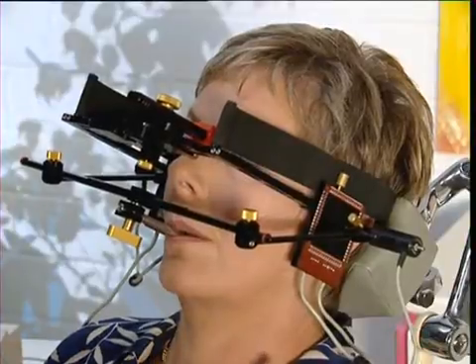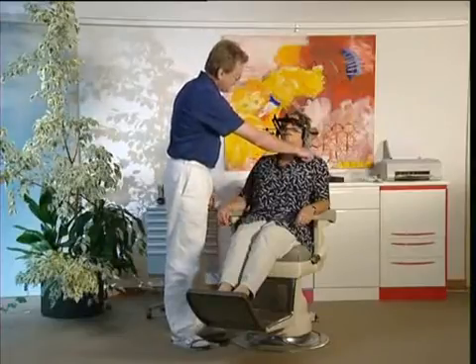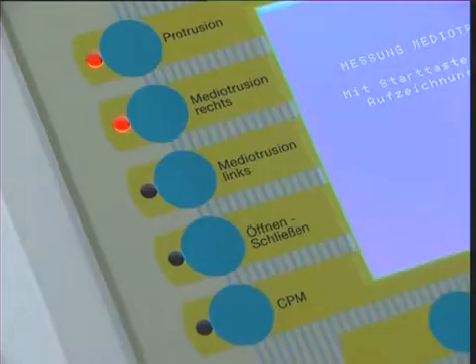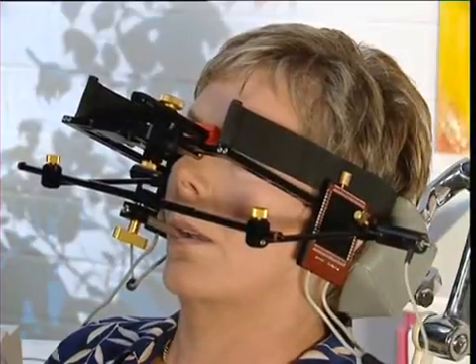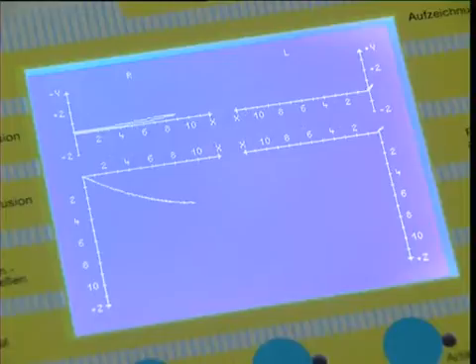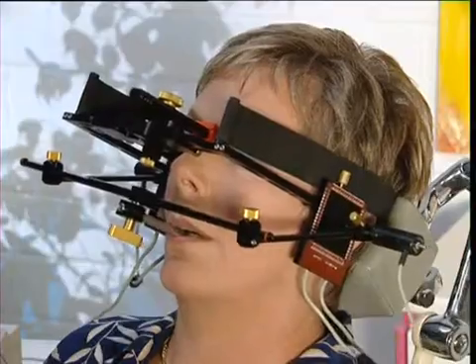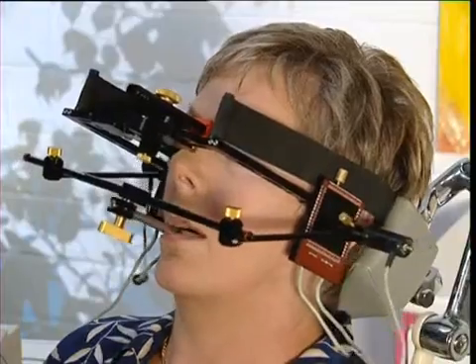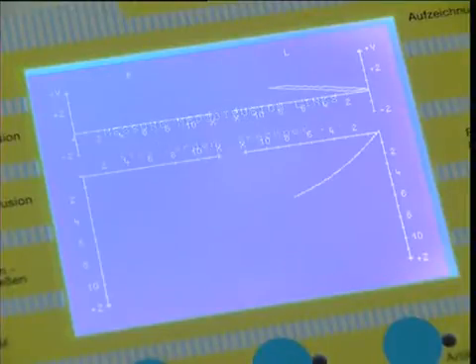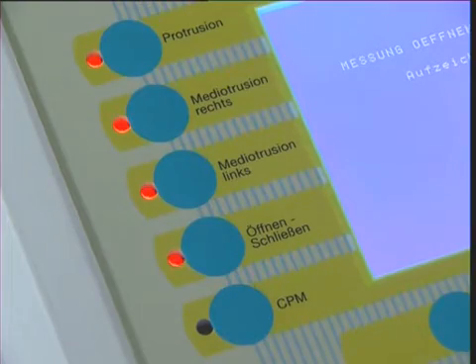The patient must always practice the specific excursions in advance. If a mediotrusive excursion to the right is required, tap the patient's left shoulder. If a mediotrusive excursion to the left is required, tap the right shoulder. The patient can now open the mandible.